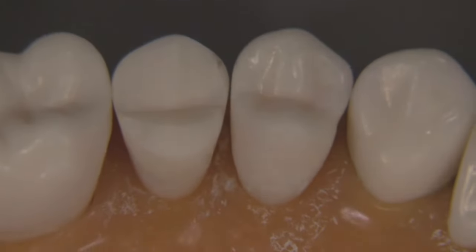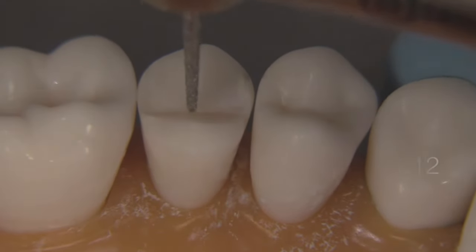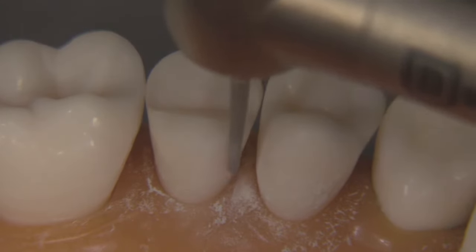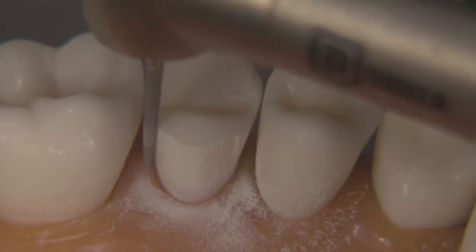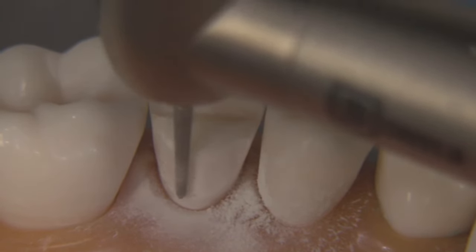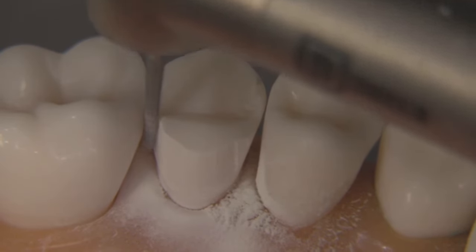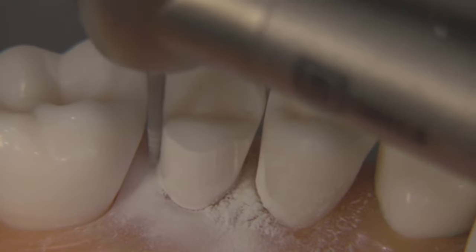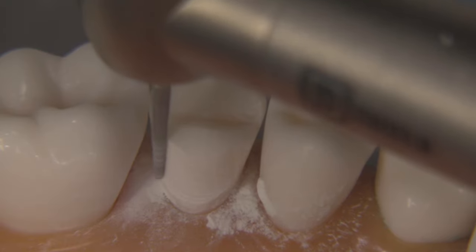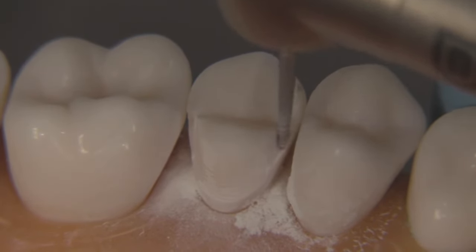Once we've got the basic reduction done, we switch attention to the axial. We're going to utilize a diamond bur called an 878K-012. Line it up with the line of draw — don't tip the bur bucco-lingually or mesio-distally. Hold it along the line of draw and plant your finger rest really securely so you don't create a line-of-draw issue, which could ultimately impact our ability to make this an aesthetic restoration. If we tip the bur too far to the facial, we'll have a preparation with inadequate retention due to an over-tapered lingual wall, and it will tend to force the flares toward the facial, providing a less-than-optimal aesthetic result.